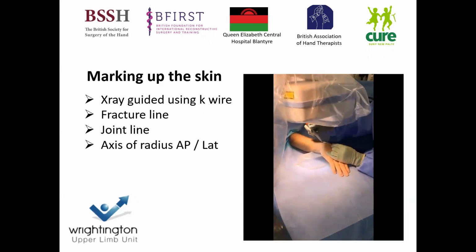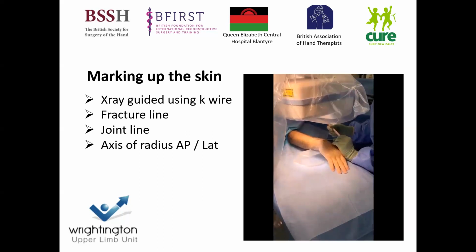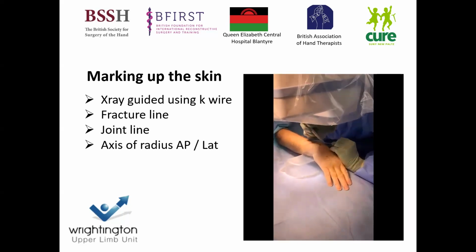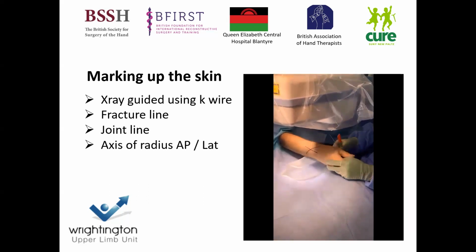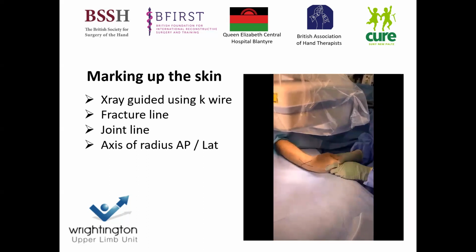Marking up of the skin is a key part that I do. I try and decrease the number of K-wire passings to the bone, just to try and A, decrease your insult to the bone, but B, the more passing you do of the wire, the more channels you're creating, the more chance there is of you going down those same wires. I also like to think that the markings of the skin allow me to get a three-dimensional understanding of the fracture and the bone underneath.